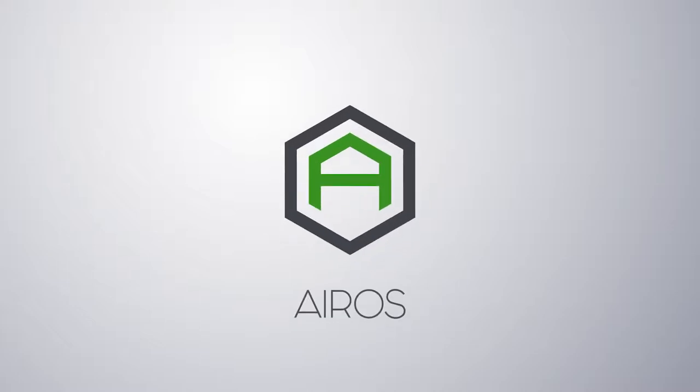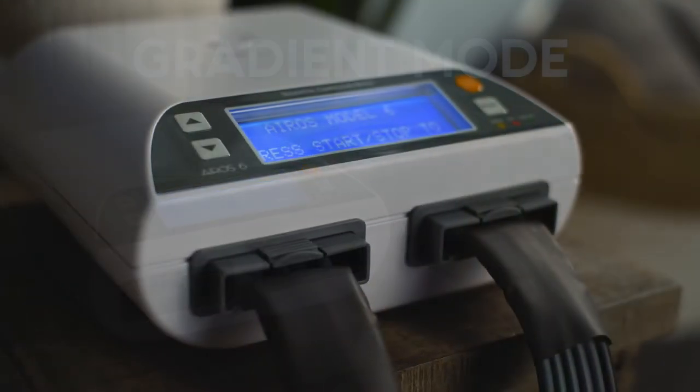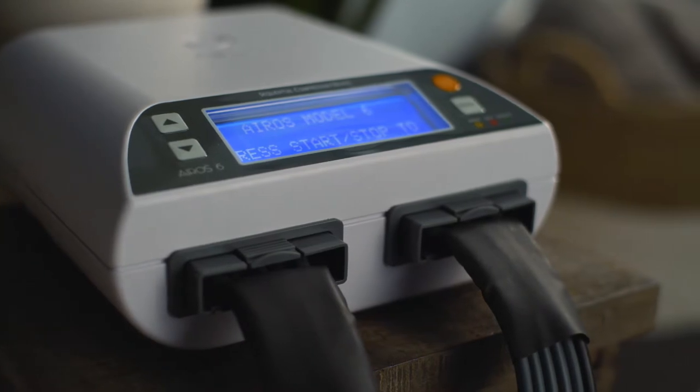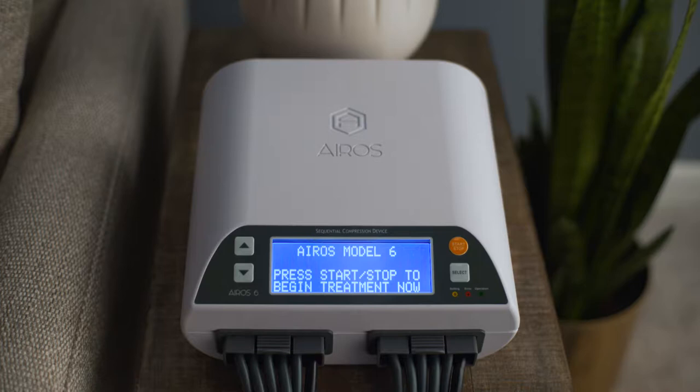The AIROS 6 sequential compression device can be operated in one primary therapy mode: gradient mode. After the AIROS 6 device is turned on, the startup screen will be displayed. The user can begin treatment immediately by pressing the orange Start-Stop button.